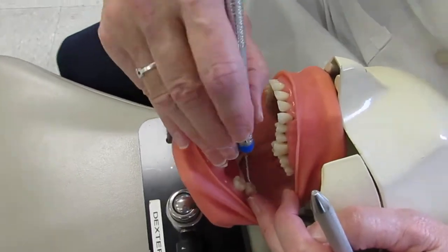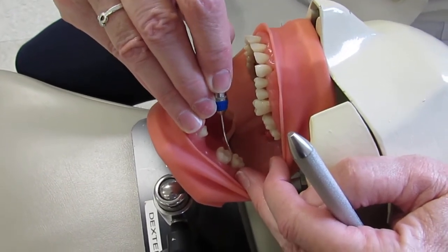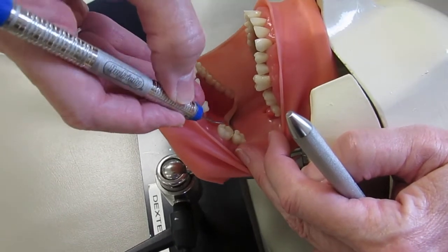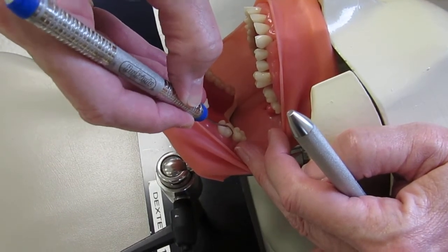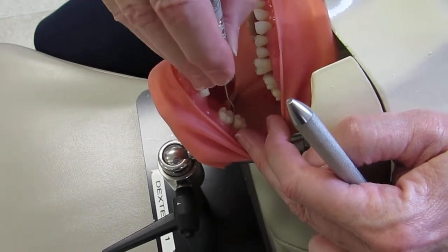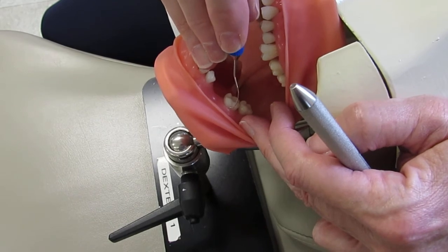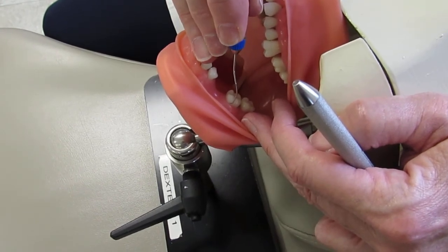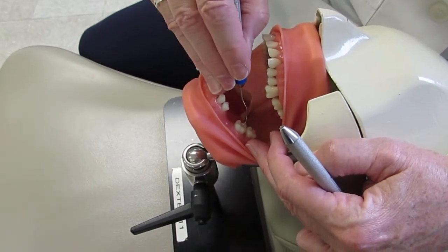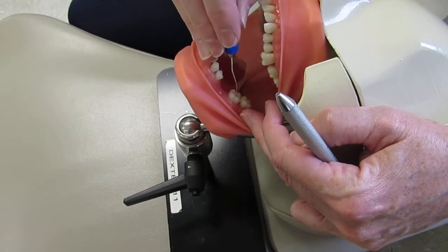Start most posterior. In the get ready zone, close so the pointed tip looks into the sulcus, walk it, come out and quarter turn. Get ready zone again, insert, come around the line angle in a horizontal stroke — that way you'll always find the calculus. Adjust the hand slightly, come up oblique in stroke direction with a light grasp. Strokes are about two to three millimeters long, rolling across, going halfway across that tooth. The central groove tells you the halfway mark — stop there to avoid poking the tissue.